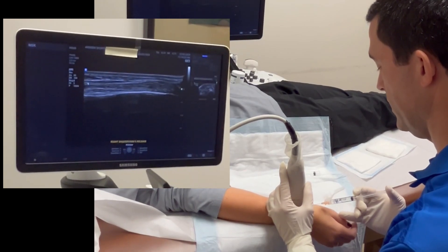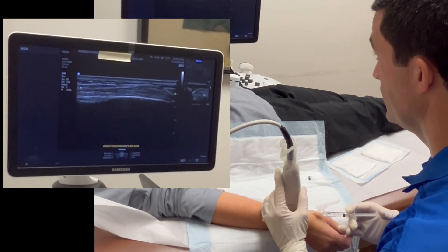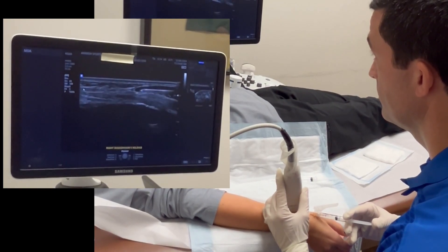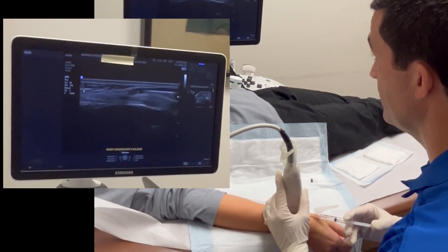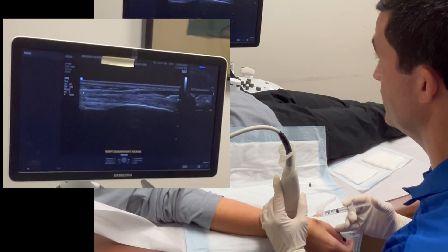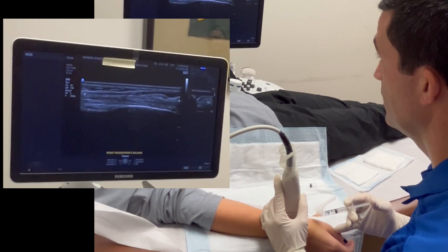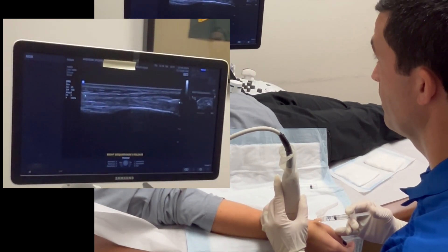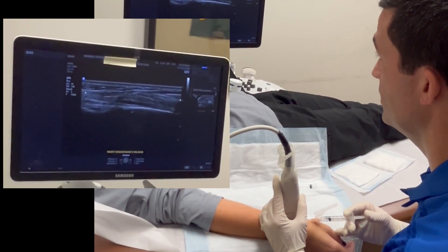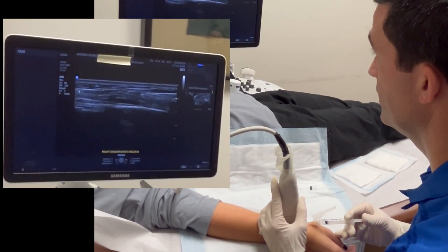We inject a little bit at the subcutaneous entry point, then advance — you can see it advancing on the screen — hydro-dissecting the soft tissue over the extensor retinaculum. That's where the extensor retinaculum ends right about there, and now we're going to inject into the tendon sheath. You can see the extensor retinaculum is thickened, which is where the tendon is getting its entrapment. Now injecting into the tendon sheath, you can see it spreading inside. I'll inject a little more into the extensor retinaculum area to ensure full local anesthetic effect.